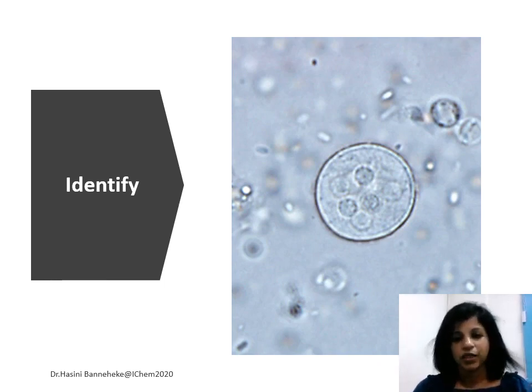So based on all these things, the facts that I told you, you decide on what parasitic species this is. Okay, so when you apply that knowledge onto this, try to identify what this is based on the shape of those cysts. As I have not given you the size, you can't decide on that, but the other structures. Take a few minutes, at least half a minute, to decide on it, and then try and see whether you can recognize what it is.